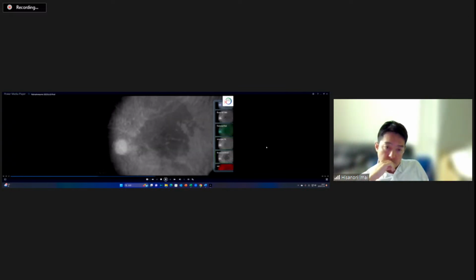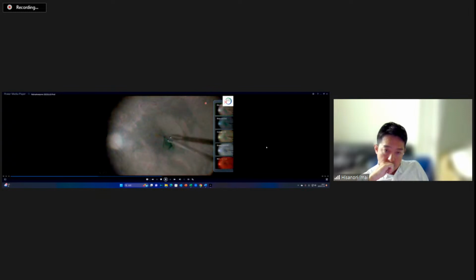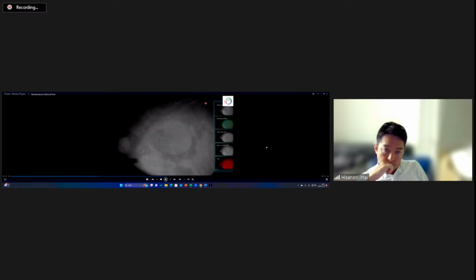The fundus was observed on color and monochrome image under blue, green, and red channel. ILM peeling was first performed under color image and then completed on monochrome image under the red channel. We can recognize that the visibility of ILM is high in monochrome image under the red channel.